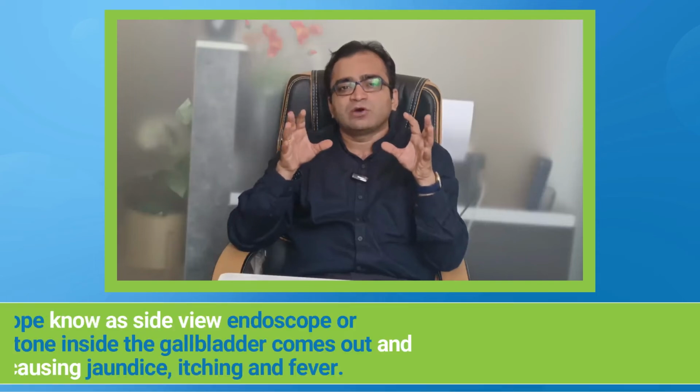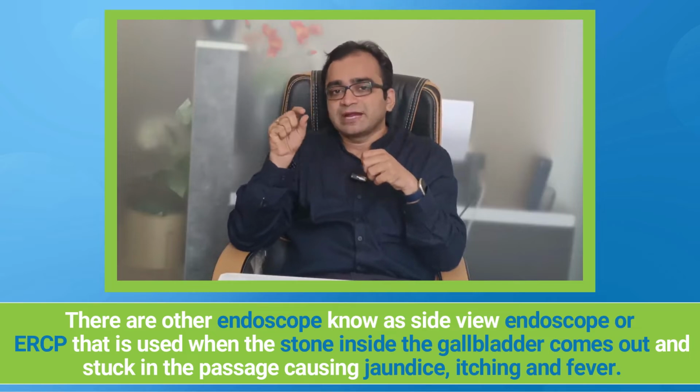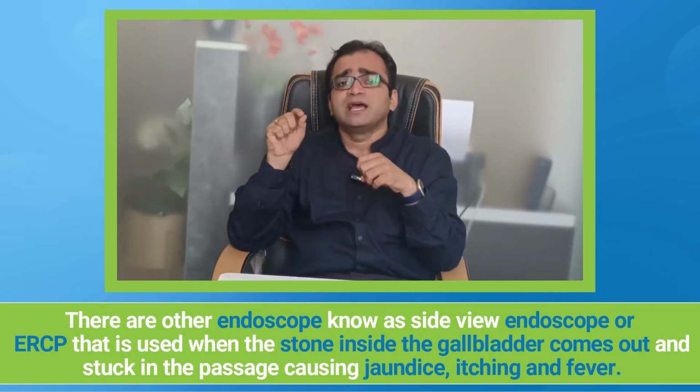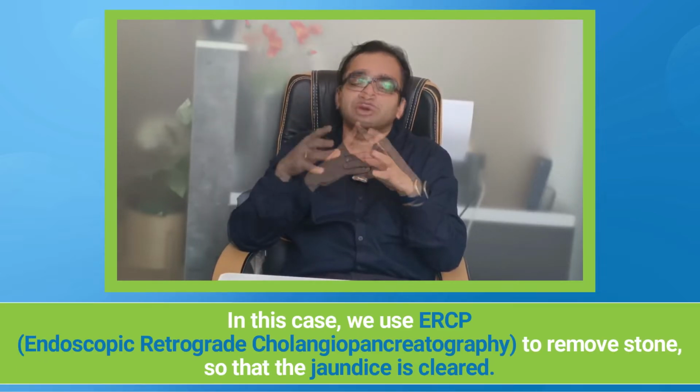So basically these are the general endoscopes. There is also something called a side view endoscope or ERCP, which is used when a stone from the gallbladder has come out and is stuck inside the passage, causing jaundice and itching and fever. In that case, we use an ERCP to remove that particular stone so that the jaundice is cleared.